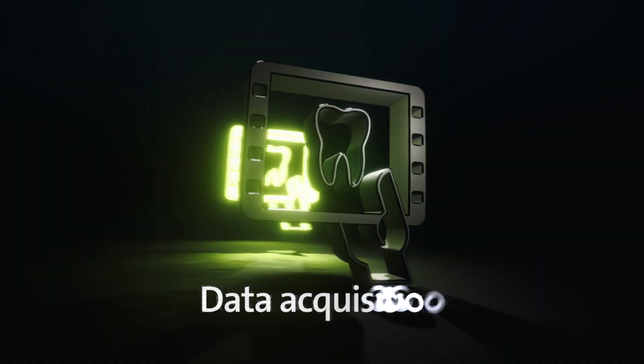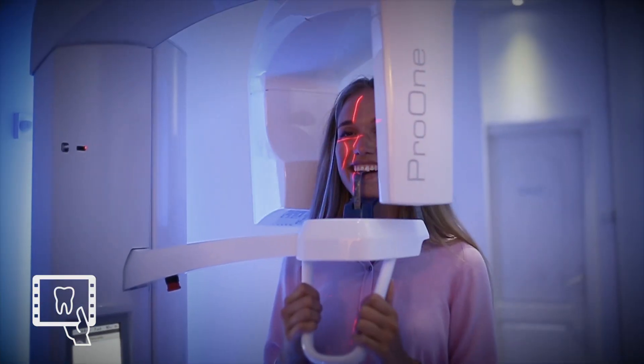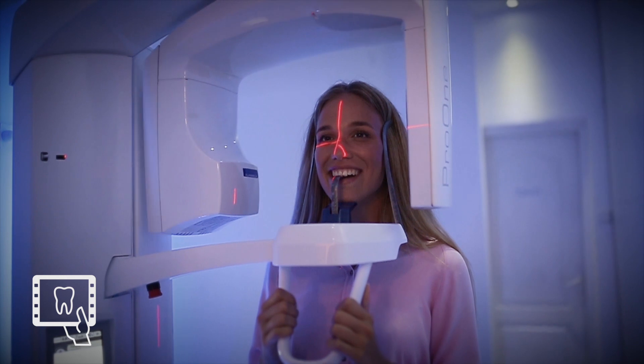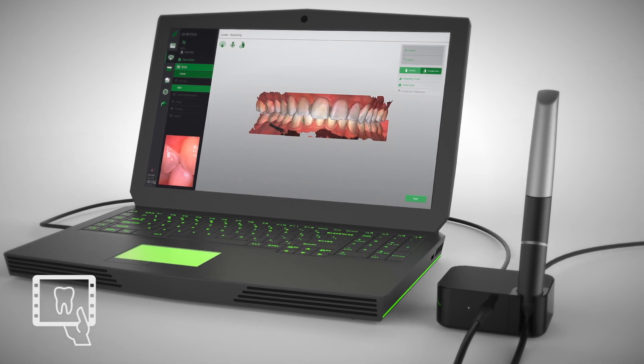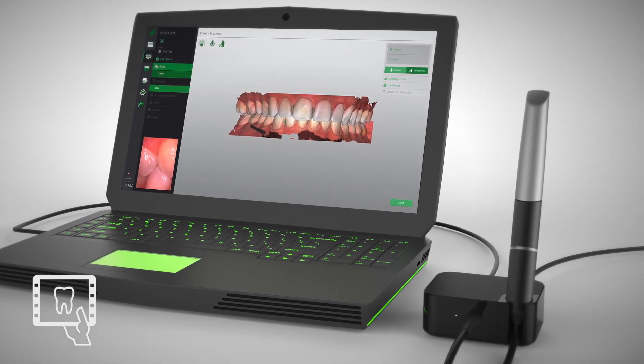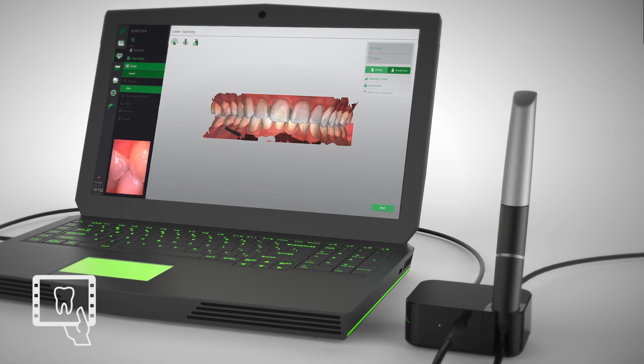Data acquisition starts with a CBCT imaging. During CBCT, ensure that the jaws are separated. Intraoral information is converted into an STL file by using an intraoral scanner or by scanning the mastercast.